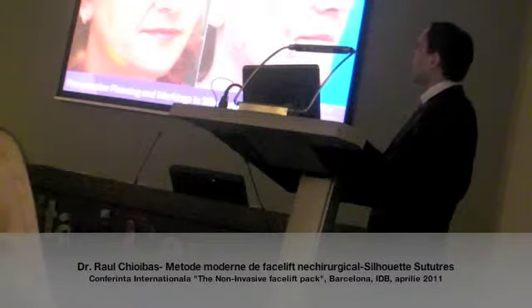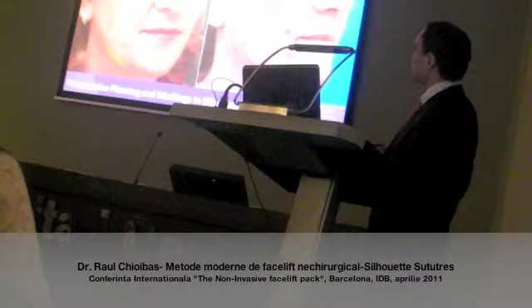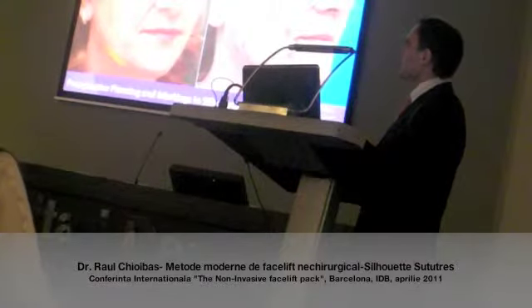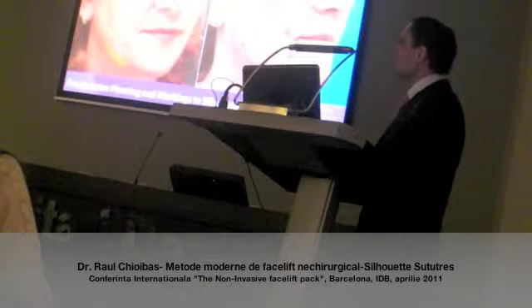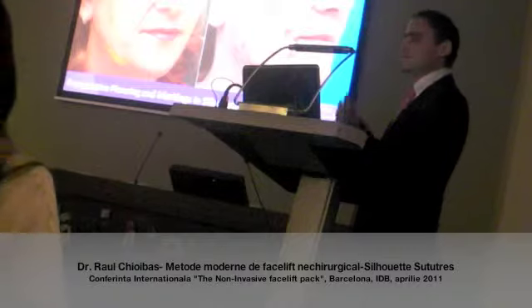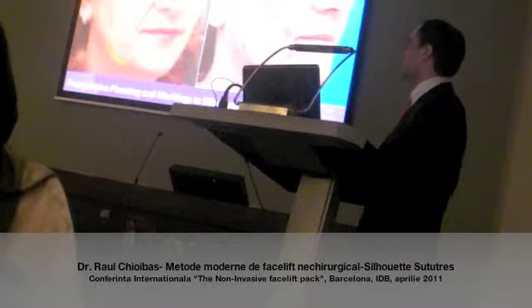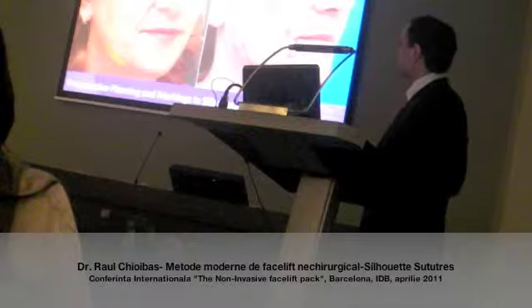Then, of course, the incision in the temporal area, which we mark from the lateral canthus of the eye, 7 centimeters for the medial landmark and 8 centimeters for the lateral landmark. I was talking with our colleagues previously, and one of them said that 2.5 centimeters is a pretty large incision considering the silhouette lift. Yes, I agree. But we usually make this larger incision because with the silhouette lift we also combine a broader dissection of the temporal area, because we think we can thereby elevate the corner of the eyebrow a little bit as well. So this is the dissection area, and sometimes, if necessary, we go until the lateral border of the eyebrow in order to get this bit of elevation.